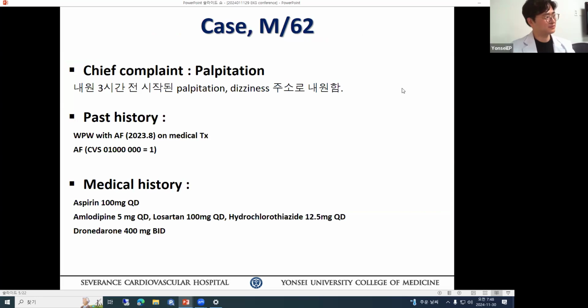The history is important. The question you should ask is, how long has he been having palpitations? If somebody has a posterolateral subepicardial pathway, a congenital condition, and has had it all life long with no problem, and then in the fourth or fifth decade a problem starts, atrial fibrillation triggers the arrhythmia, resulting in pre-excitation manifestation. However, if the patient is 18 or 20 years old coming with this, it is different.